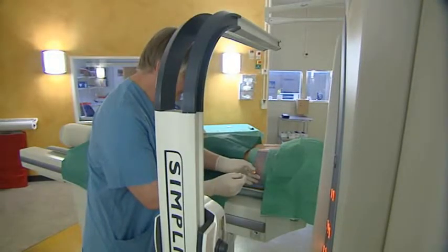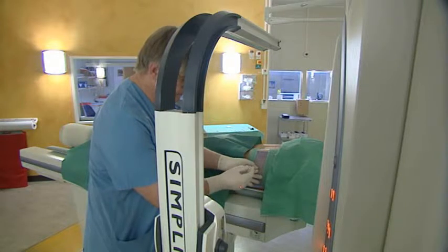Again, notice how the needle is placed in line with the laser light when the dot is illuminating the needle hub.